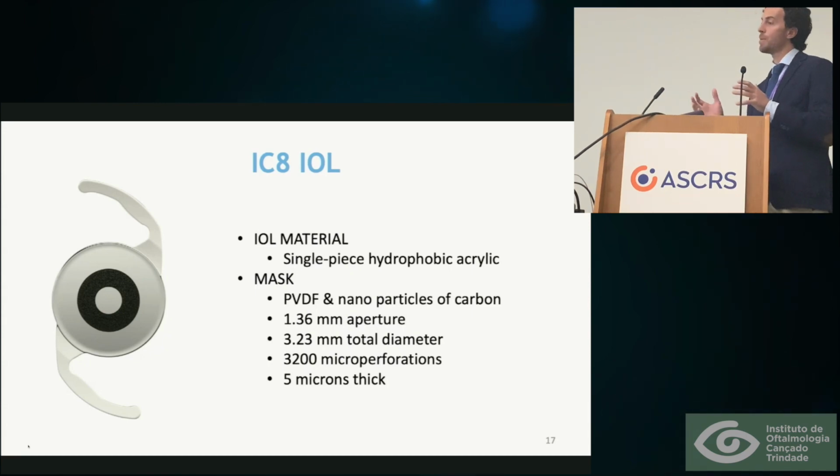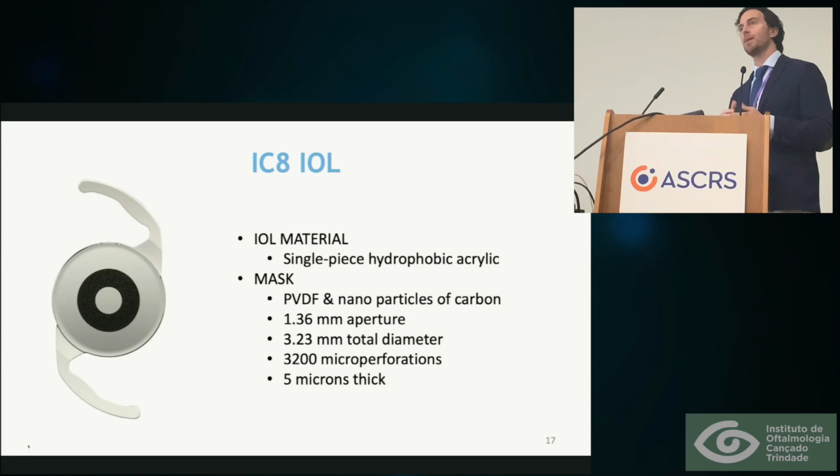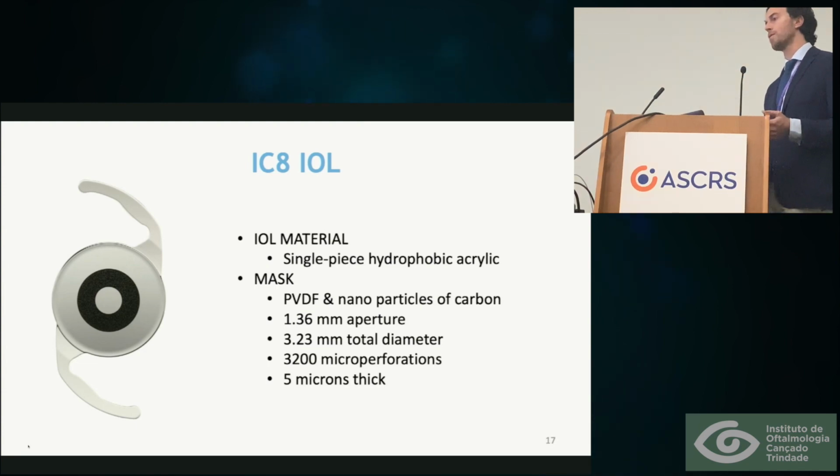I have my experience, and Roberto can tell something, in patients that have no aberrations, I wouldn't recommend it, honestly. If they don't have aberrations, just for presbyopia, it's more difficult. You have to spend much more time because the trade-off is bigger. I love the extra focus for that.